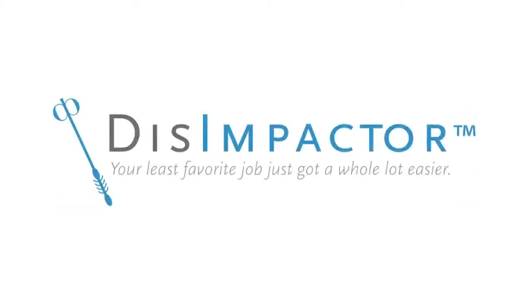this problem, and that's why I invented the DisImpactor. So let me go ahead and introduce the device and show you a DisImpactor and how that will keep you from having to perform digital disimpactions at all. So let's take a look at the device.